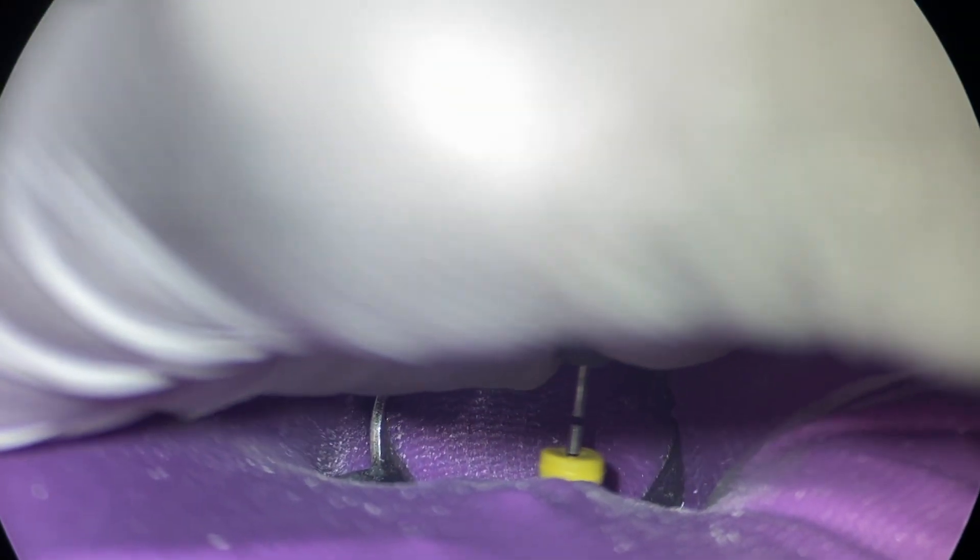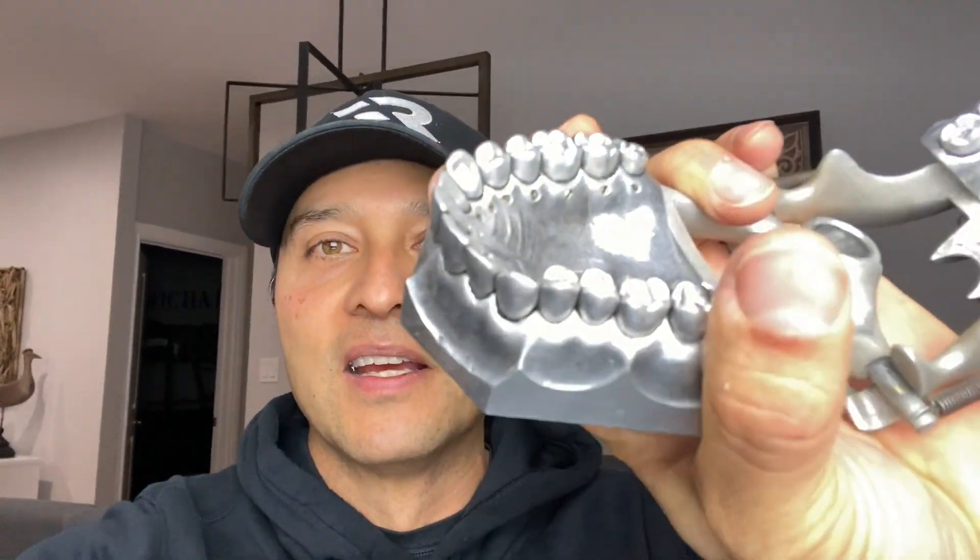So I'm going to show you, I was going to demo it on my good old metal dentiform. I found this in the basement. I was going to do another demo, but the demo actually answers a lot of questions. So I'm just going to leave it the way it is. Look at this bad boy. There's like metal teeth and little screws. So it functions really well.